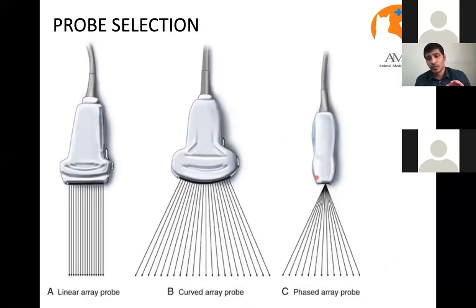This probe we most commonly use for intrathoracic examination, mostly for cardiac evaluation, because we don't have enough space between the intercostal muscles. So we need a very small area. What happens from here, the echo sound leaves and it covers the bigger area down here. But in this probe, it already has the big area when it starts. So it's not suitable for chest cavity evaluation.